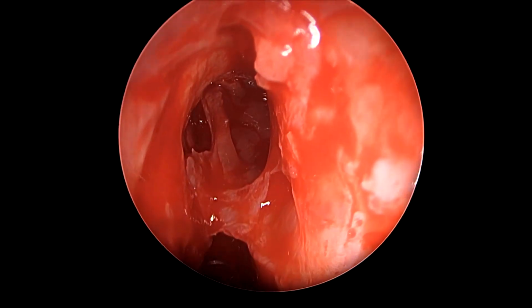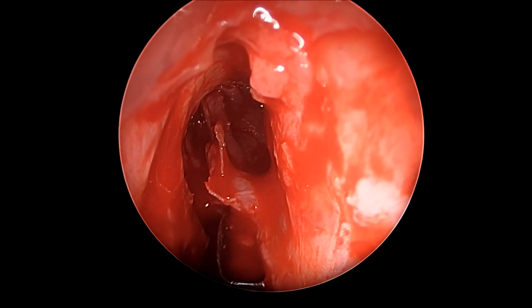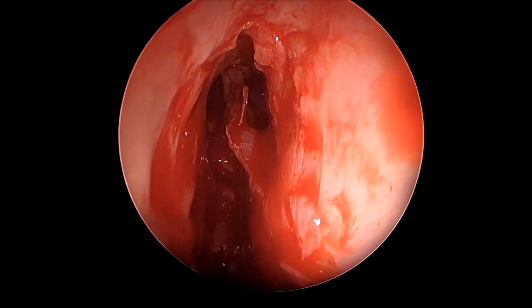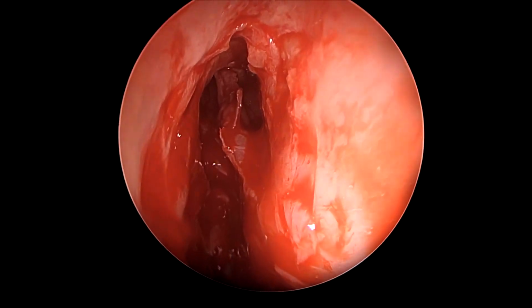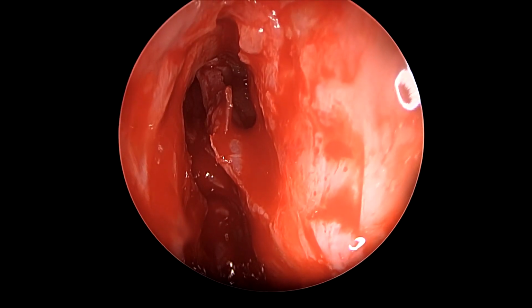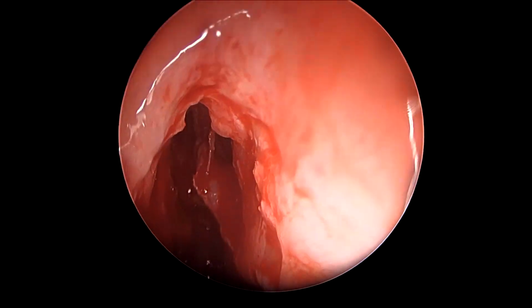And this kind of access and vision inside the frontal sinus is only possible because of the removal of some portion of the frontal beak. And this is short of actual drilling, which would be required in some more cases if the pathology were to be more lateral to the mid-pupillary line.